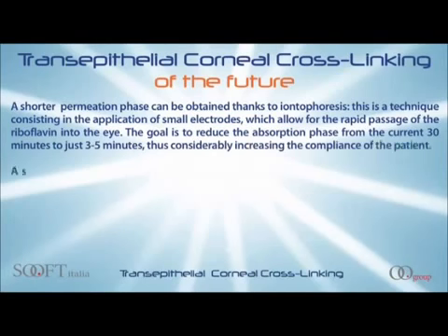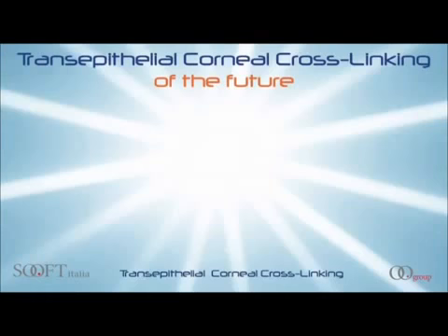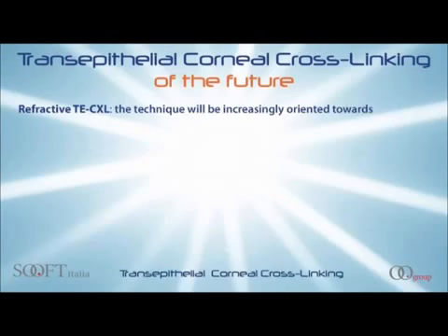A shorter irradiation phase thanks to the use of higher power irradiation sources with respect to those which are currently employed. The prospect is to achieve a total treatment time shorter than 15 minutes. Refractive transepithelial corneal cross-linking. The technique will be increasingly oriented towards the refractive aspects of the diseases being treated.